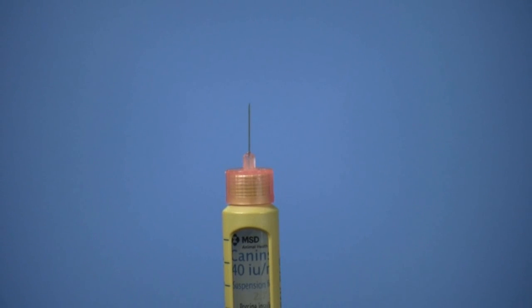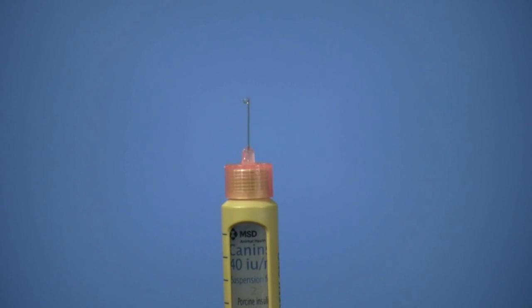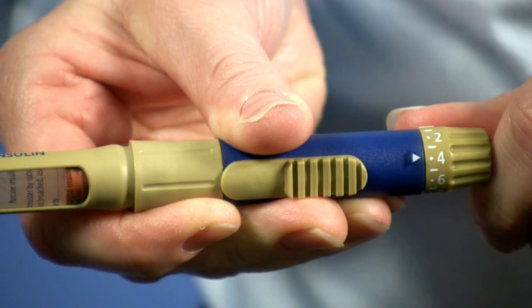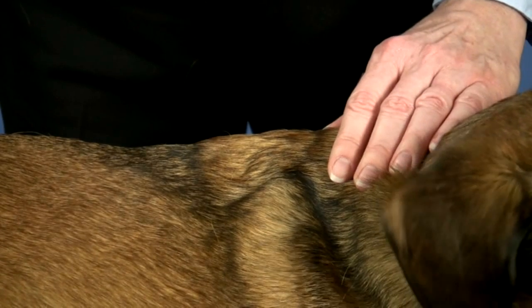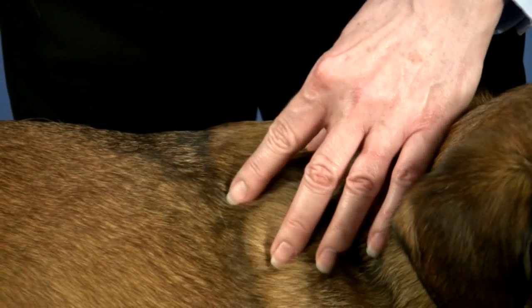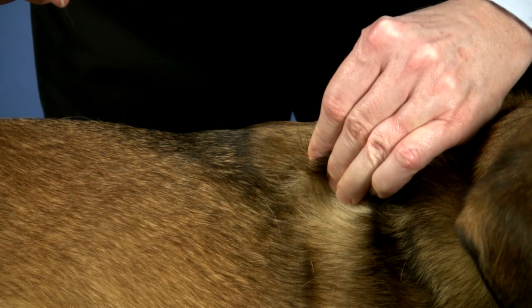If you select a dose that is too high by mistake, expel the incorrect dose safely and then select the correct dose. Do not attempt to forcefully dial back to a lower dose, as doing so may damage VetPen and result in inaccurate dosing. Usually, insulin injections are given under the skin 2 to 5 centimeters or 3/4 of an inch to 2 inches from the center of your pet's back along its flanks.